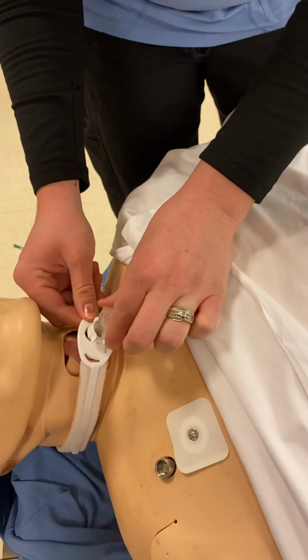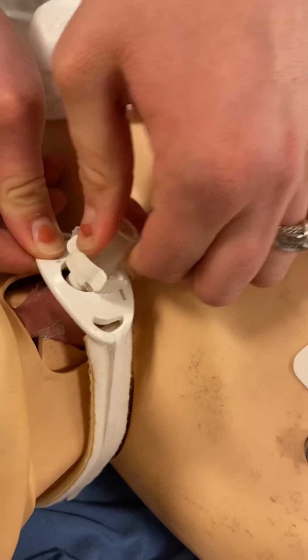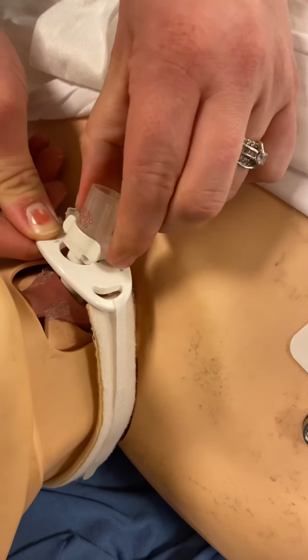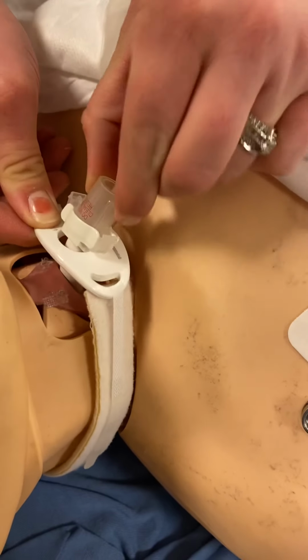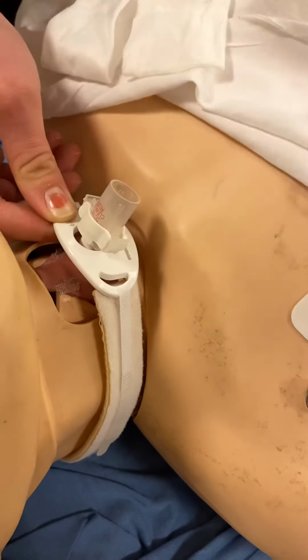So you're going to twist it down, and then you're going to pinch, and you want to make sure it clips in, so it doesn't pull back. Because if I didn't push it down all the way and I just set it in, then it's off on this side and can easily pop off. So you want to make sure you clip it down in and it's secured.